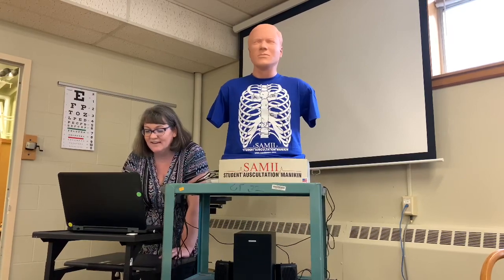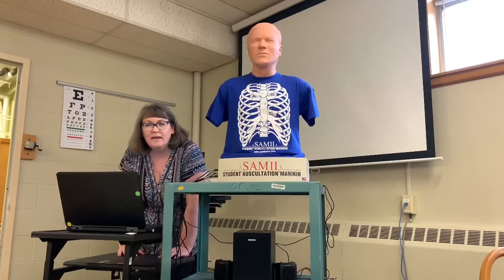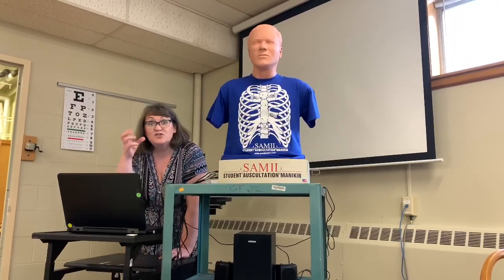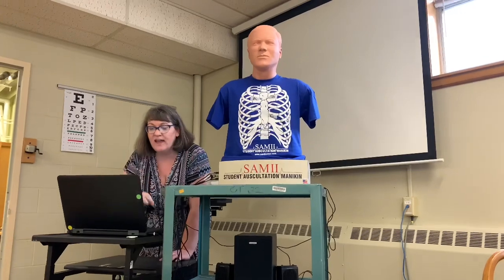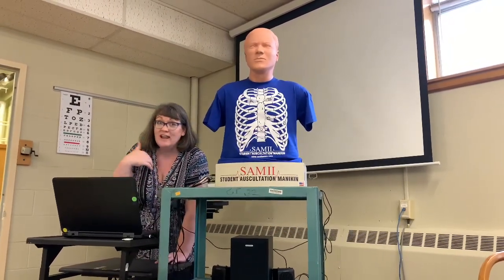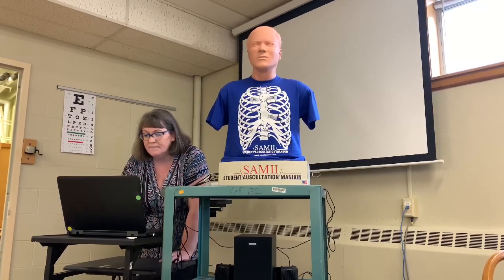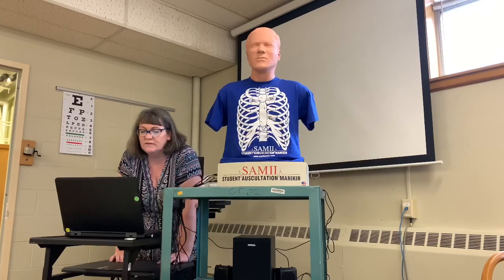Good, wheezing. It's very loud, so I apologize. And what does wheezing tell me? Constriction of the bronchioles, right? Okay, and usually I hear it on end expiration, whereas with the crackles, I hear it on inspiration, okay? And then let's do this next one. You tell me what this one is.